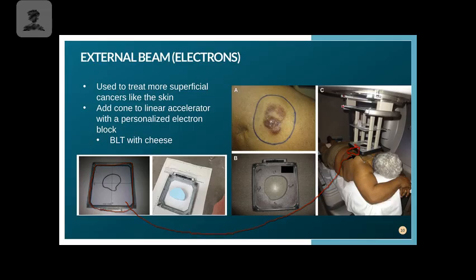Then you shine the light from the gantry down at the patient, and you bring a Sharpie onto this glass and draw over the shape of the tumor that's hovering above the patient. You're still a couple inches away from the patient's skin, and you use the shadow of that Sharpie to help guide you around the shape of the tumor.